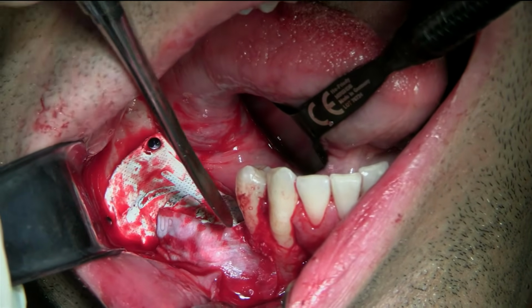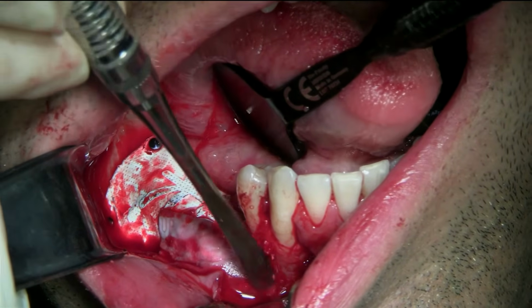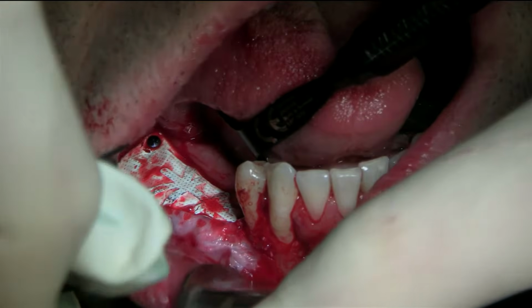So I'm covering that area where I made a little opening for the mental foramen. That's good. Okay. So now let's just do the cheek because we're going to start suturing.